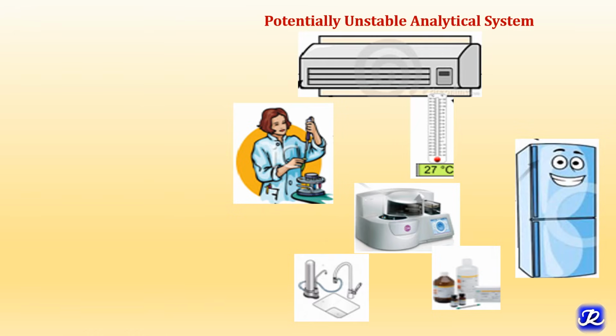So all these things make the analytical system potentially unstable. We cannot guarantee that every day the analytical system is stable, because there can be variation in temperature, there can be any error in the instrument hardware or software, or a change in the personnel doing the test can also result in errors. So these are the causes of a potentially unstable system.